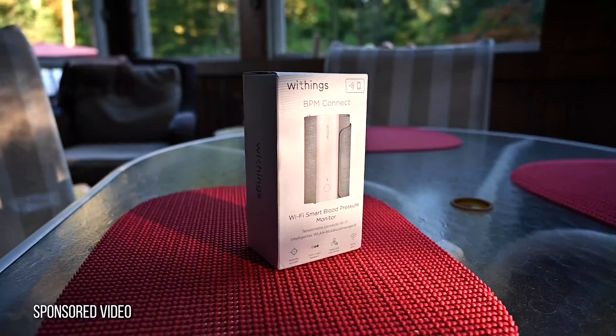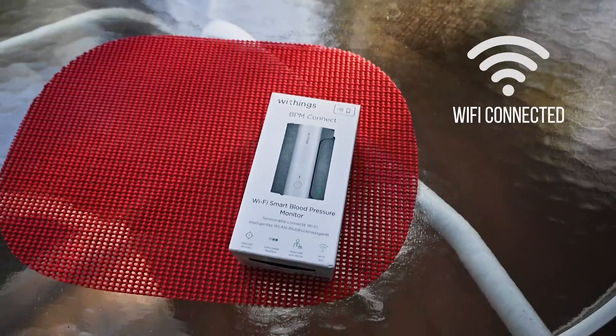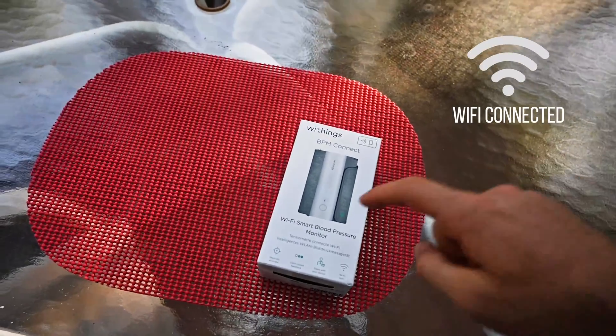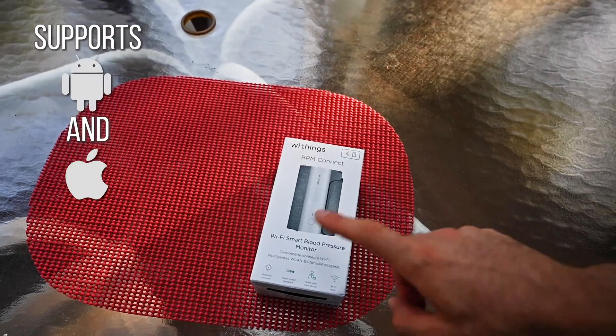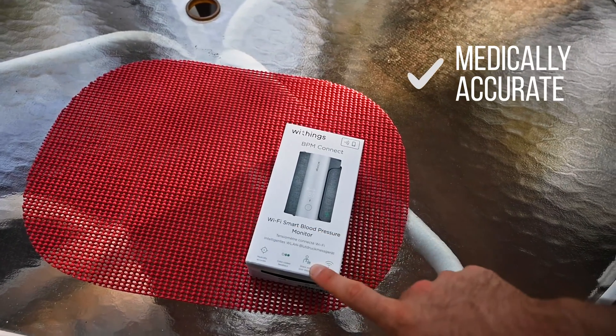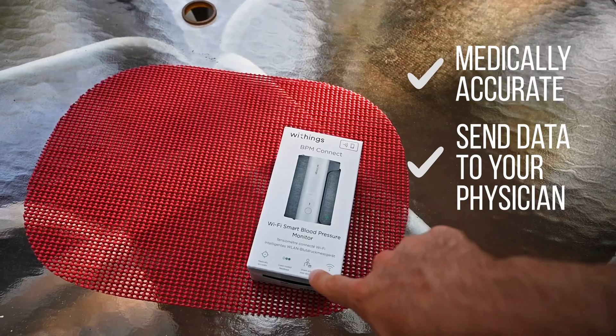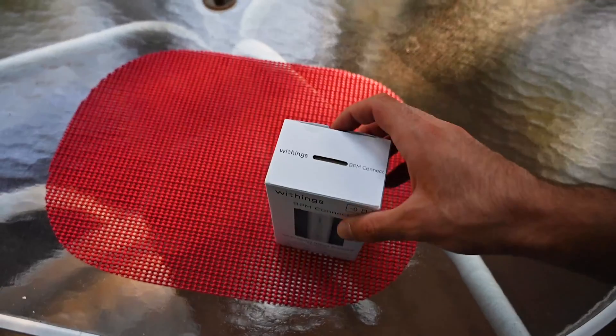So what I got in the mail was the BPM Connect from Withings. Super excited about this — it's a Wi-Fi connected blood pressure monitor. It will connect straight to your iPhone. It's actually sold by Apple, so super cool. They're saying it's medically accurate, and you're able to share readings with your physician. Super easy to operate, so let's get it opened up and check out what's inside.